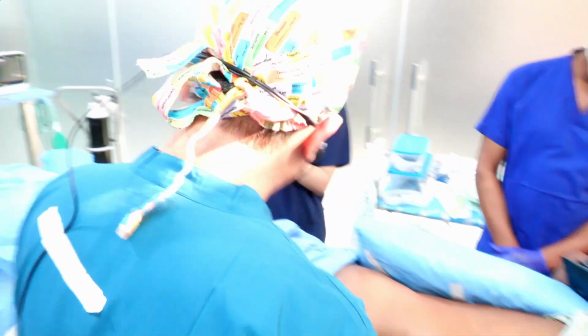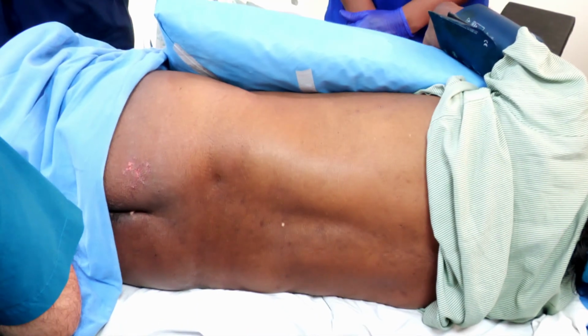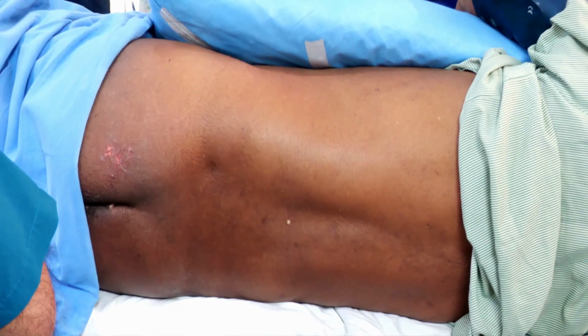So everyone, we are starting with the 77-year-old male with left neck of femur fracture, and we will be giving the lumbosacral plexus block. Dr. Sandeep Diwan sir will be giving the block, so he'll demonstrate it now. Am I audible, Dr. Devesh? Good morning, sir. You are audible.